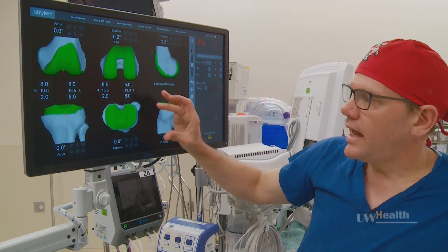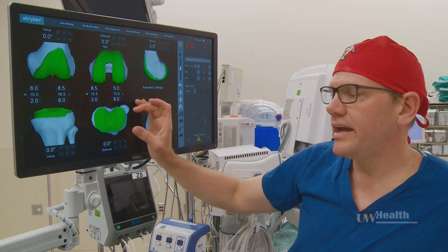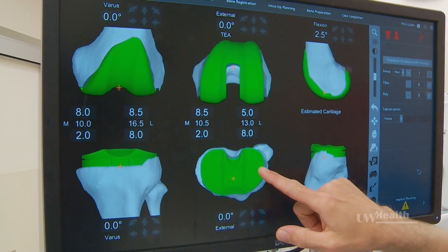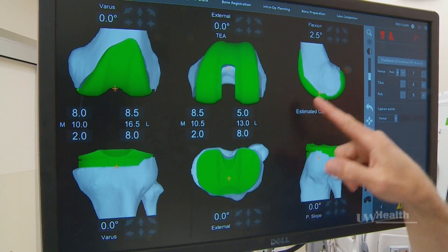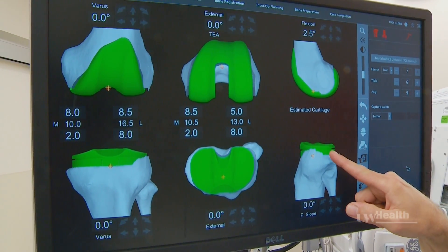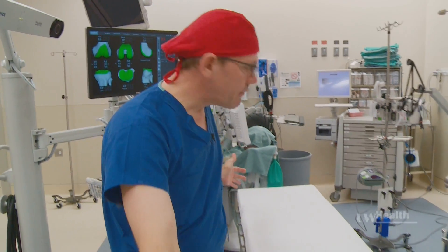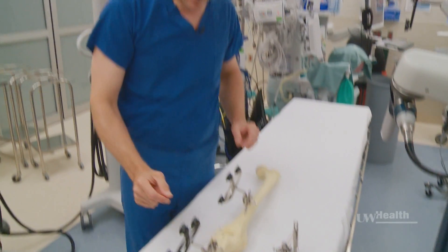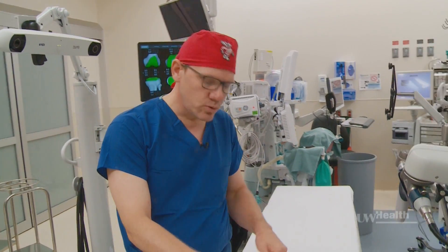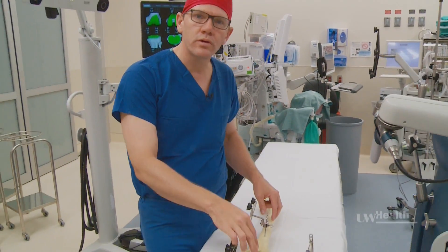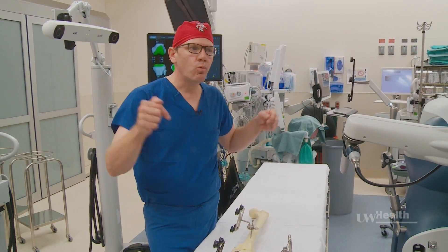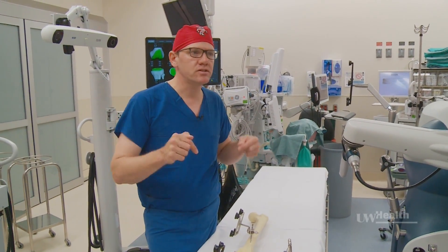The tibia piece, rotated properly and sloped properly — each of those things have an important impact on outcome. We then have a patient laying on an operating room table just like this. We have to put pins into the bone because I have to educate the computer about where that patient is in space.